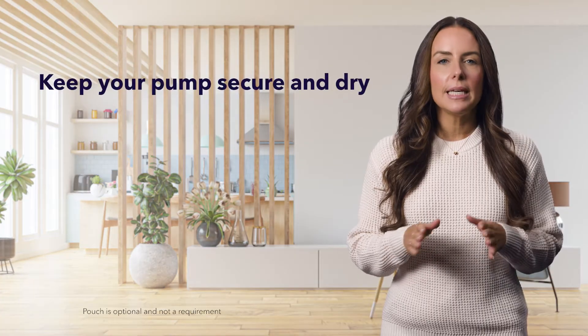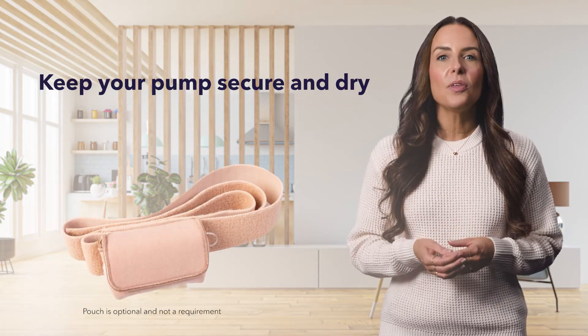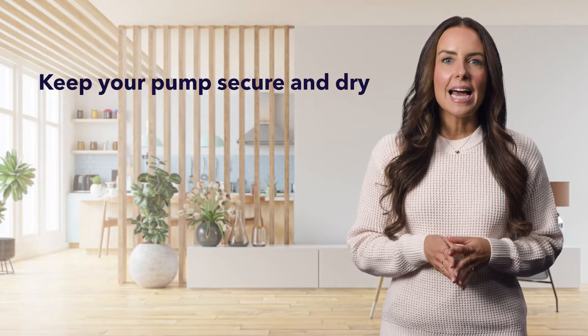First things first, keep your pump secure and dry by wearing it in a pouch and with the buttons facing away from your body.